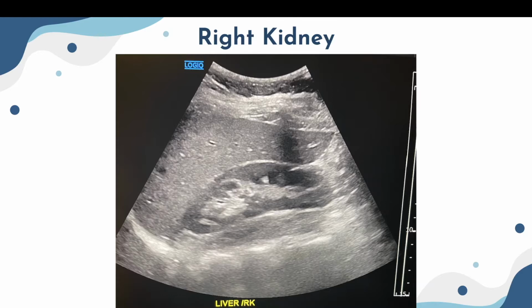What are the new innovations that are coming in the ultrasound field nowadays? New innovation as far as technology or as far as scanning? As technology and scanning, what new things can you do now that you couldn't do, let's say, 4 or 5 years ago? MSK is very big nowadays. We couldn't really do that before. Pediatric imaging is coming up a lot.